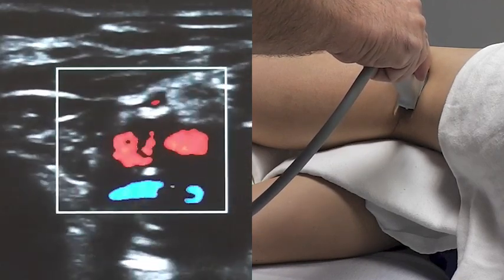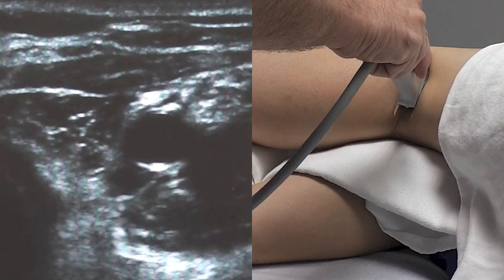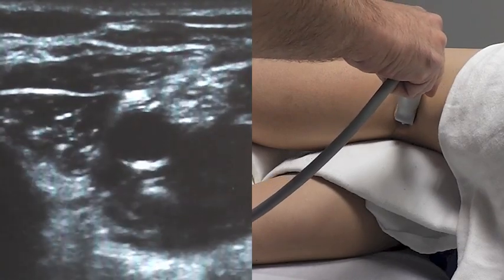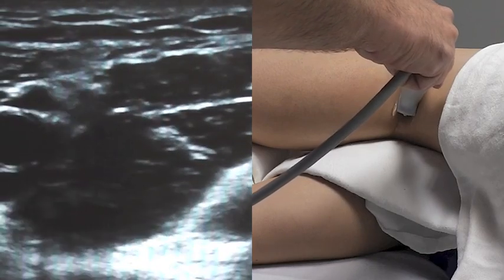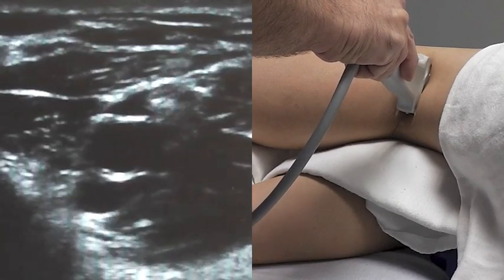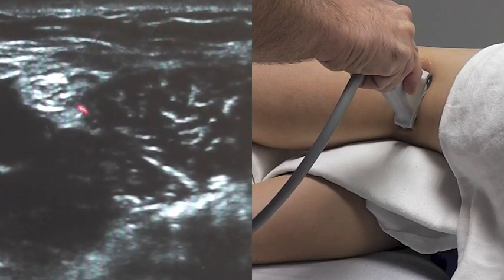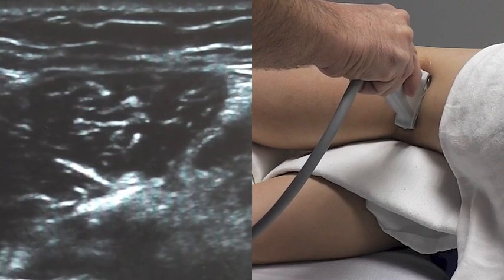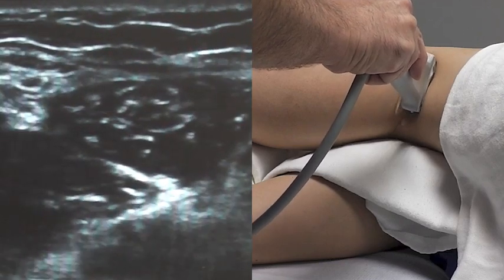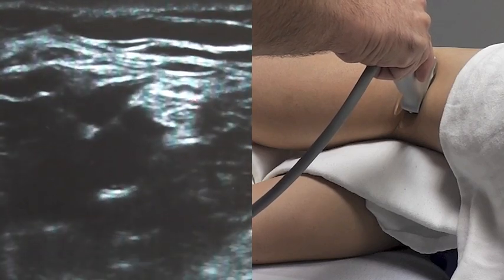So we've now identified the artery and vein. Having done that, we're going to look for our nerves sitting just adjacent to those structures. Watch as I move the probe gently — what an enormous difference you get in the picture. The most subtle movements can cause your picture to be maximized where you can see your nerve, or you can lose your image altogether. I'm going to re-slide the probe laterally to reacquire the image, and we've found our nerve sitting right here adjacent to the vessels.